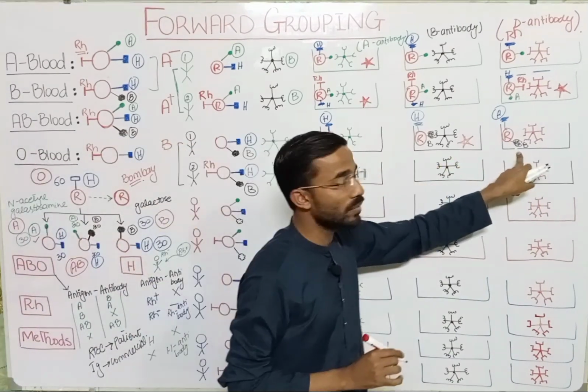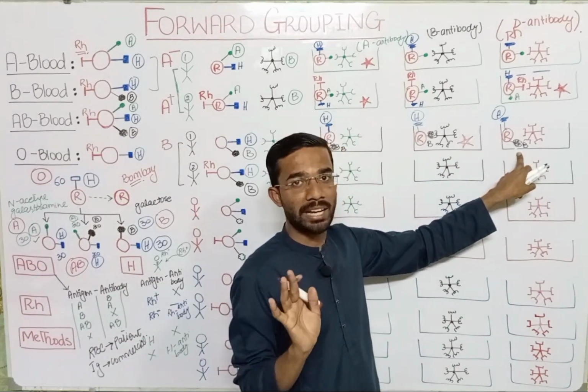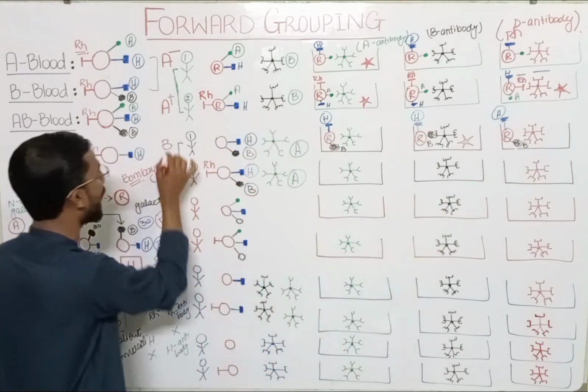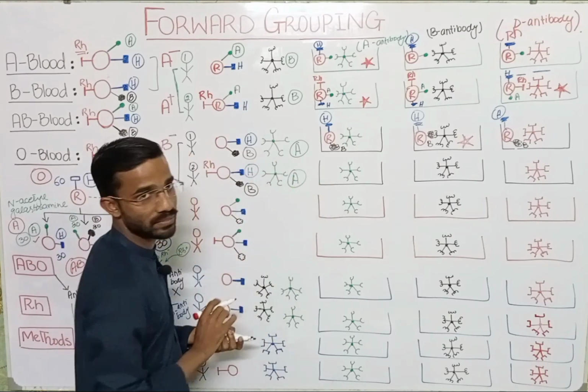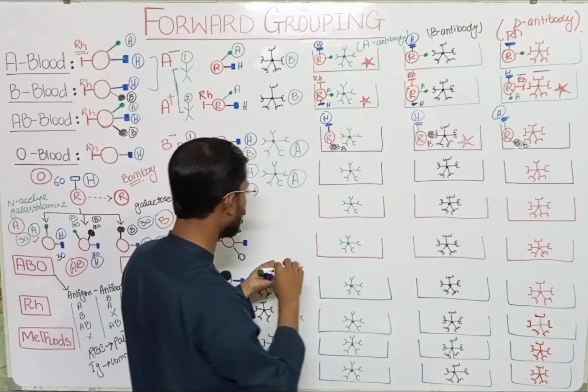So in the last case, you didn't see any agglutination. So on the basis of this, I declare it negative. So here is the case. Second one, when I add the blood in this tube, then what will happen?